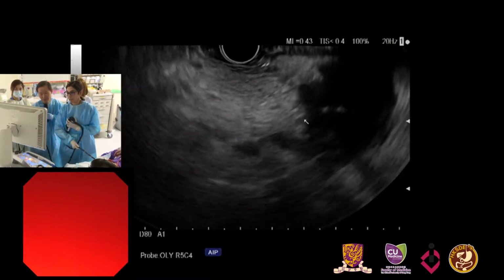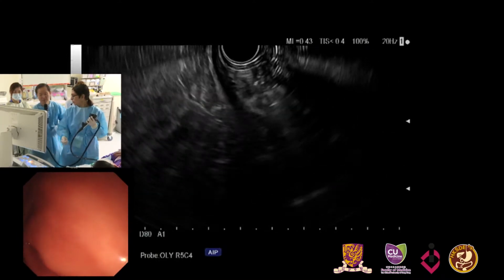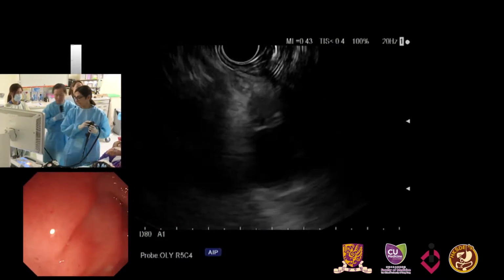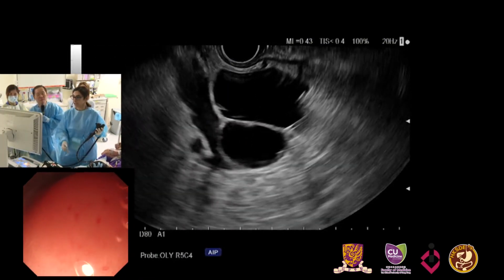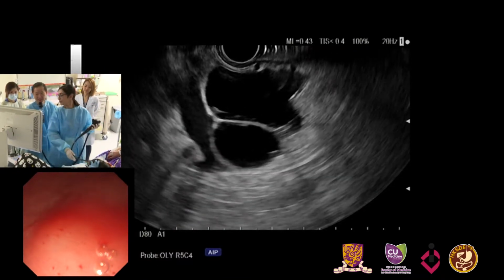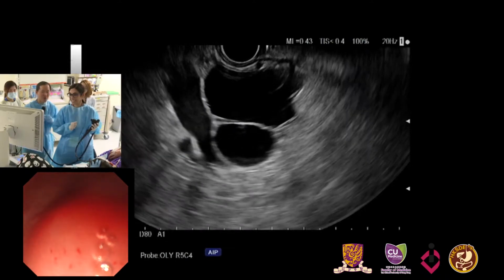Yes. It has been growing in size over this past, I guess, 8 years. And so it's not very rapid growth, but it is growing. And there's no other worrisome sonographic features at this point. So I guess for our panel, the discussion could be, we have a couple ideas of some advanced imaging modalities we can do. But the question is always, do we really need it? Since we already have an idea. We'll probably do it today, but that's not a definitive diagnosis. If we have more data, then we can get a more accurate diagnosis.